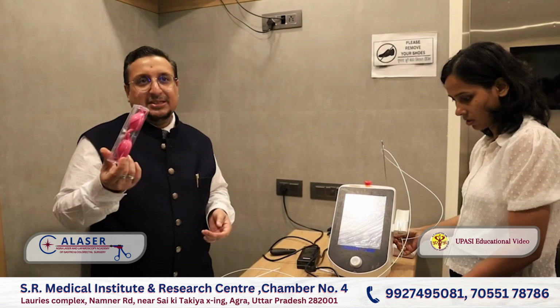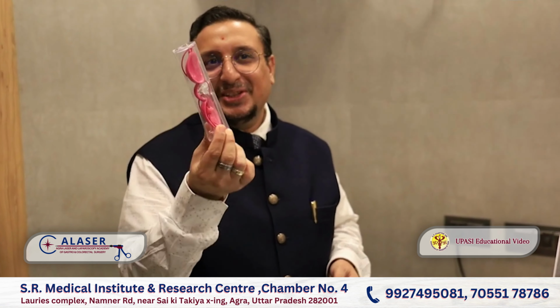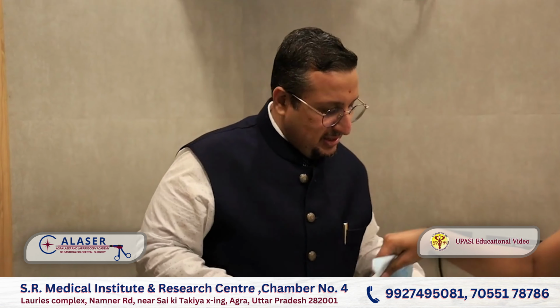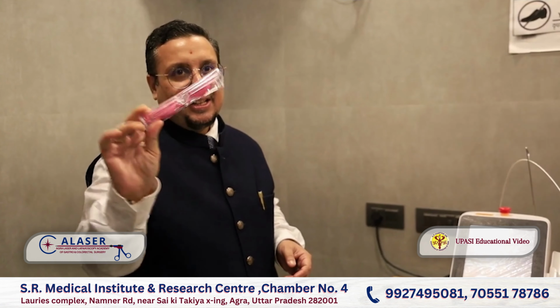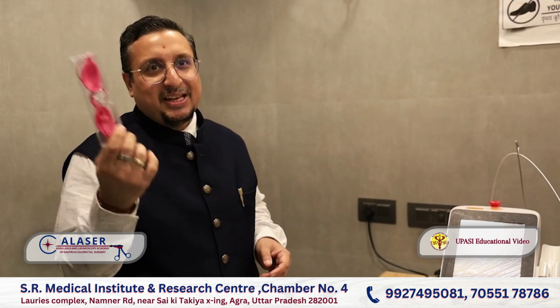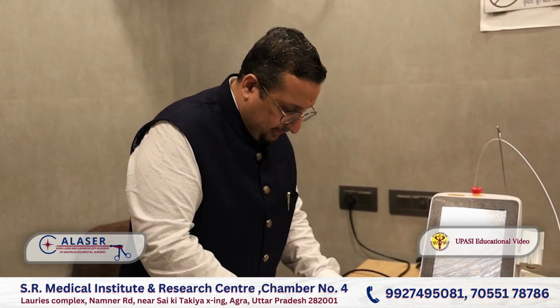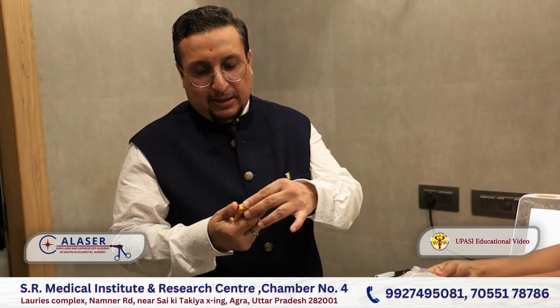Any guesses? What is this? For the patient, not for the doctor, right? So these are your goggles for doctors, right? Doctor, you understood what is this? Eye cover. For whom? Patient eye cover, right? Okay. These are the goggles which we are using, specific wavelength goggles, right? Fibers. This is the cutter. Fiber is inserted inside this, and we cut it.